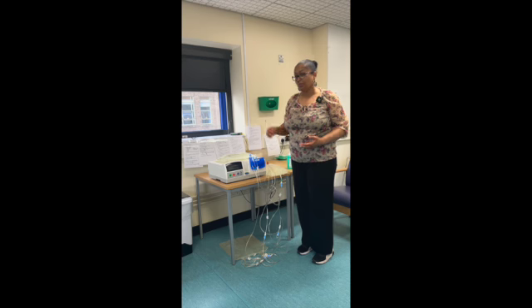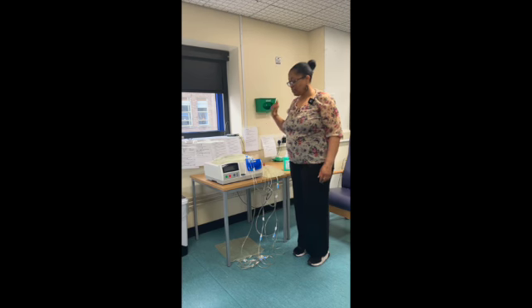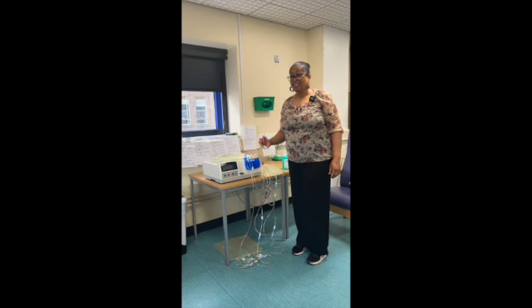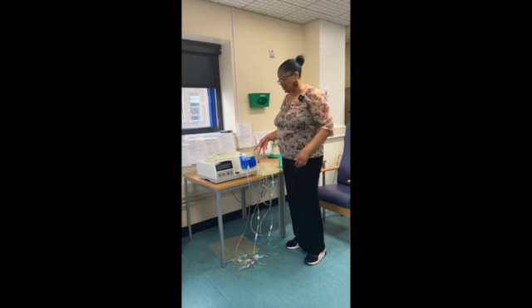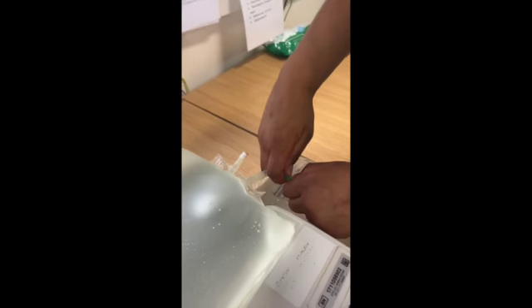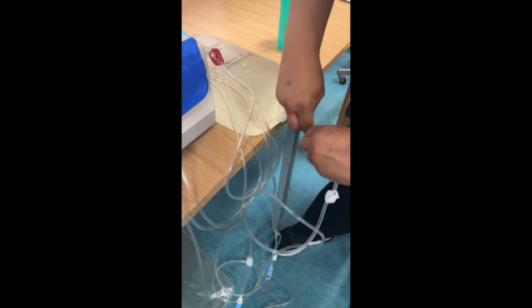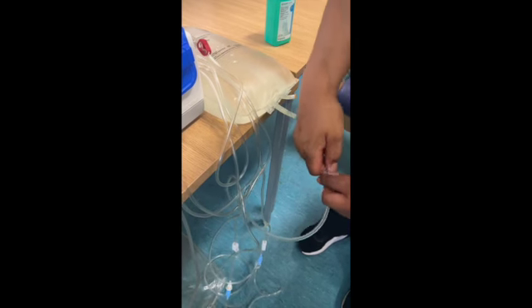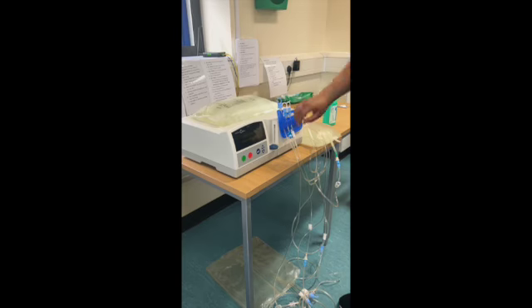I'm now ready to connect to the machine for the dialysis session, but before I can do that, I have to make sure that the machine is primed. Now this process makes sure that there's no air in the lines, because if there's air in the lines, it's very, very painful. So to start that process, I have to break the seals and open the clamps. The most important clamp for me to open is the patient line clamp.